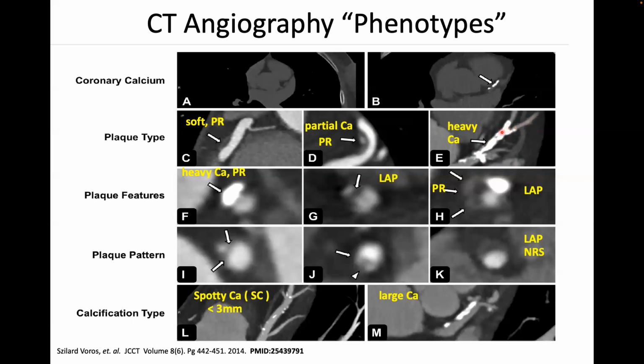The calcium has a signal amplitude that's 3x that or more, right? Or 5x that. So this is super bright, and you're looking for a channel in here that is of this amplitude. That's hard, because if there's any blurring of this very large signal, it will lift up the signal inside the channel. It'll be hard to see inside that channel.